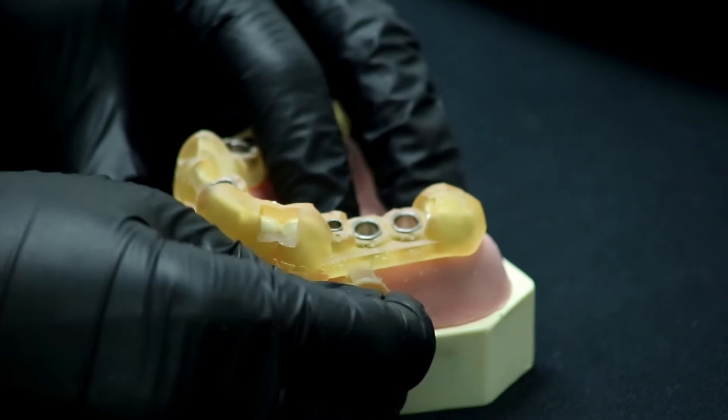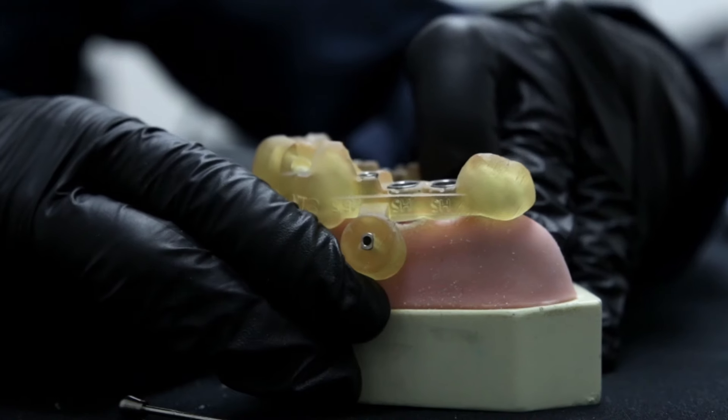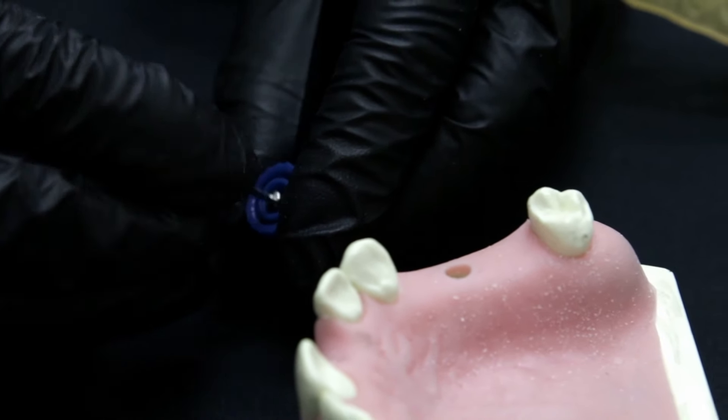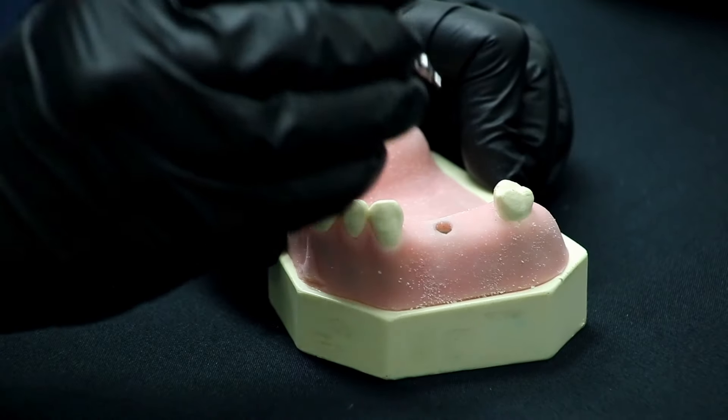Remove the entire kit, the anchor pin, and the guide. Place the implant cover with the 1.2 hex driver present in the kit, and the implant is installed.